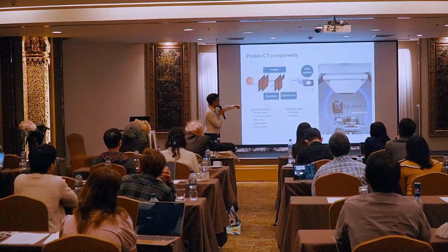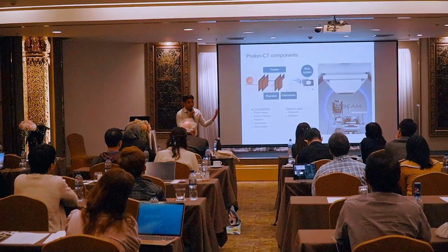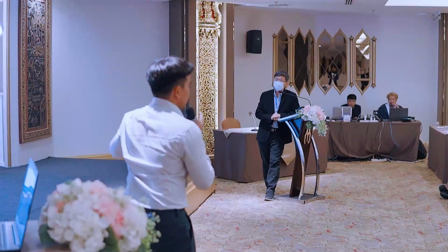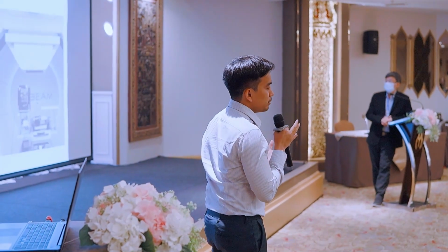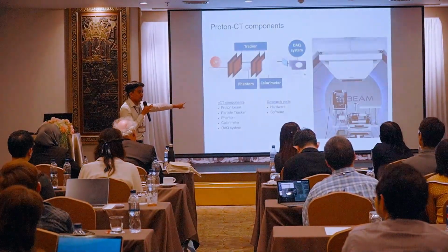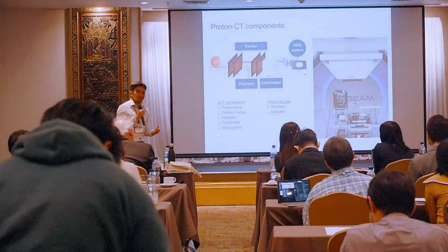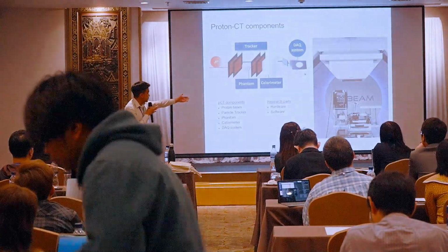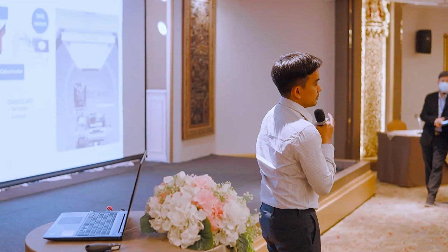No. We don't have them, because we have only 6 sensors. We use the same sensor to test the tracker. I just test the tracker to show that we are really able to track the proton. And then I take the same sensor and turn it into the calorimeter and test the calorimeter. So I would say this one doesn't have the tracker yet because of our limitation of sensors. Okay.